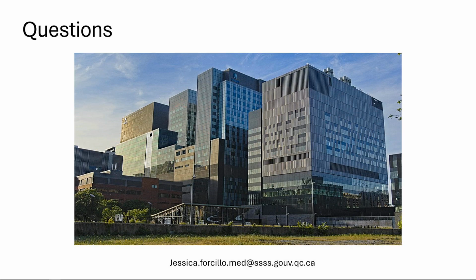And sometimes, as surgeons, we recommend TAVR, and the cardiologist will say, no, you should have a mechanical AVR, because mechanical AVR is still a good solution for our patient, and it goes to just 1 procedure.